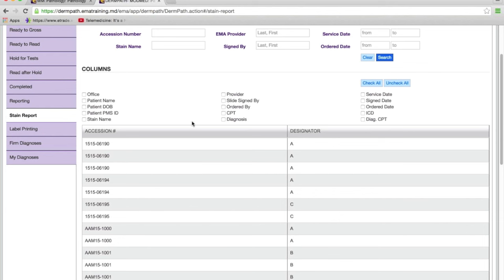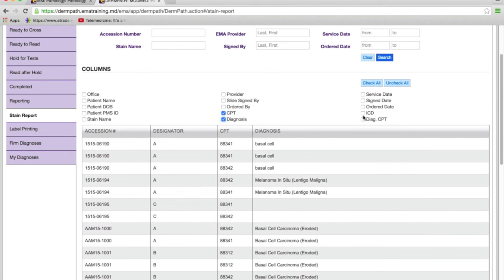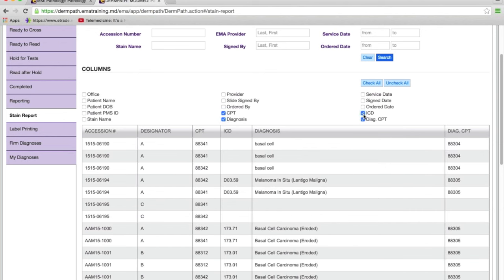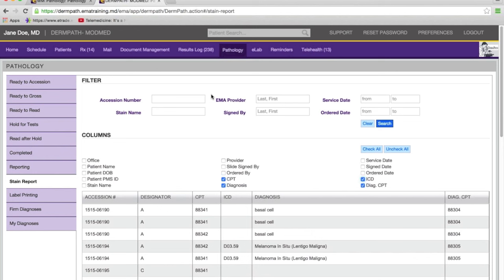The same applies to stains in the stain report. You can look at all the stains you've done, their CPT codes, the diagnosis, and so on. For those who don't have a bridge to the PM system, this screen will give you all the information you need for billing.